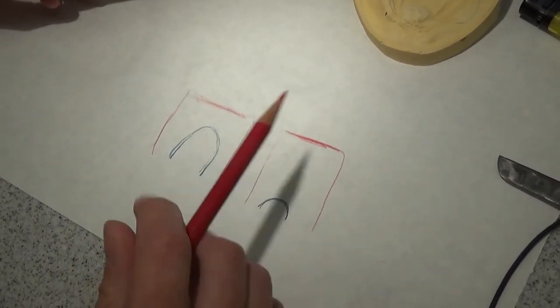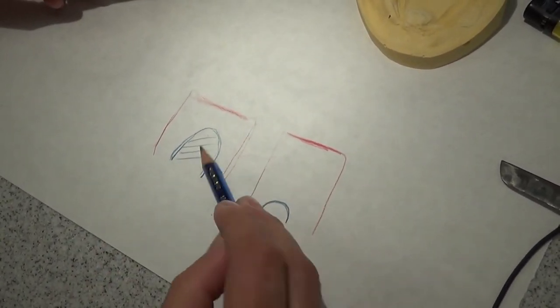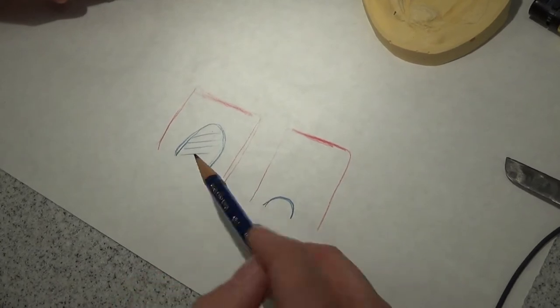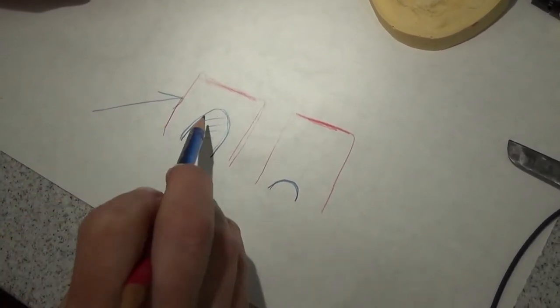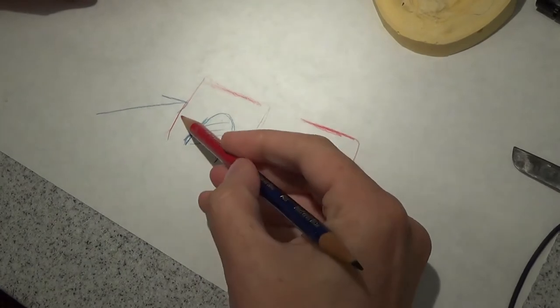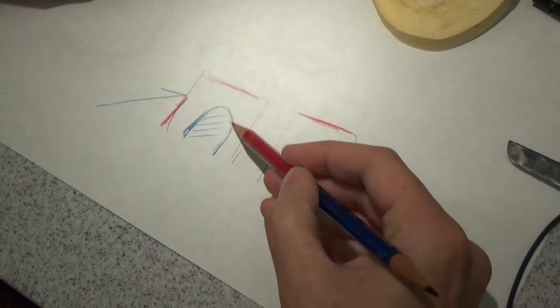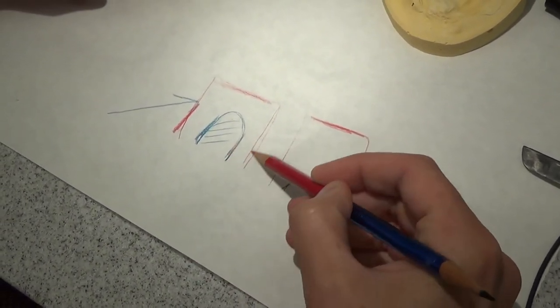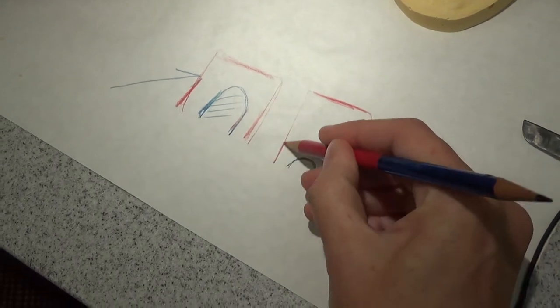If a patient has a lot of remaining ridge and it's tall and I have these parallel walls, if I come in and put force on this, this is going to resist movement of these walls and vice versa. This wall with this wall. Same denture.